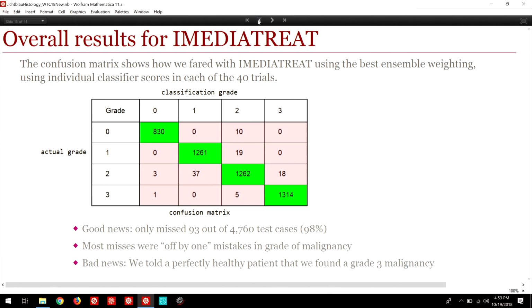And so what does this mean? It means that this method is making its mistakes in different places, by and large, from the other methods. And so when it's wrong, the others tend to outvote it anyway. When it's right, its heavier weighting tends to overcome the fact that several of the others might be wrong. So it's an offset. It's a nice balance.